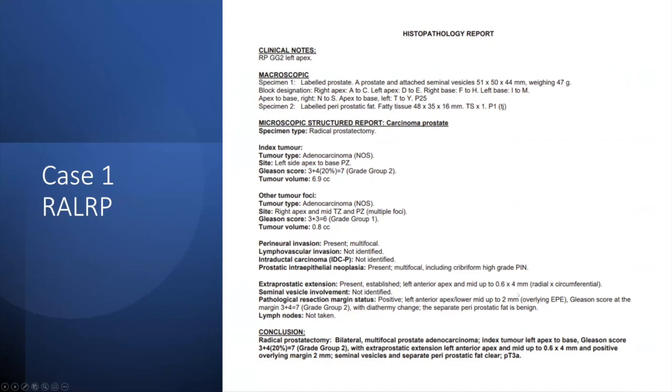Yeah, and I think surgically, certainly our surgeons just want us to outline where the tumour abuts the capsule. And we actually have a planning meeting, as a team-based approach, where every single patient who comes for a radical prostatectomy has their images reviewed with the biopsy, and we make a plan prior to surgery as to what sort of surgery they're going to have, what approach to use, what sort of nerve spare to do, and whether or not they're suitable for a neurosafe frozen section type option.